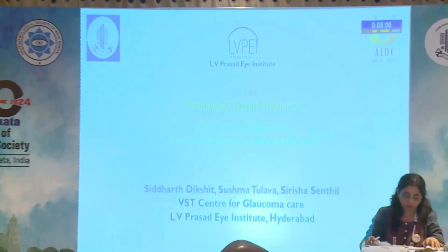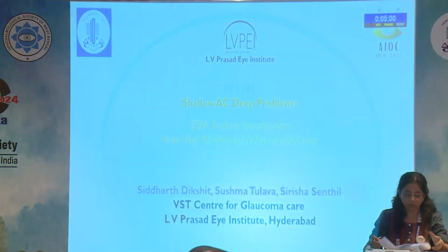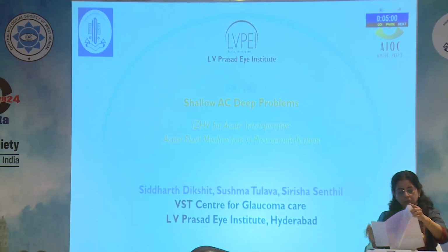Thank you. And as you heard, it is about acute fluid misdirection and iridozonulohyaloid vitrectomy, IZHV, in that acute setting. So we did a retrospective study to assess the outcomes of IZHV as the treatment for acute intraoperative fluid misdirection. And this was over a period of 5 years that we were able to find seven cases.